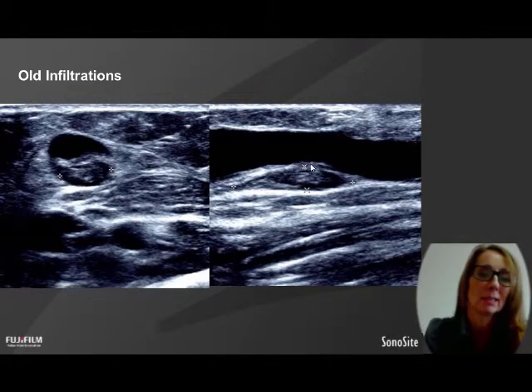Just made a slight little hole in the intima. The blood has filled that intima and reduced the actual lumen size quite dramatically. And you can imagine that on this cannulation they wouldn't have been successful. They would have possibly tried to change the angle, but if they didn't have ultrasound, they wouldn't have realised, and they would have probably abandoned. And then the next person who comes along would see that people have been cannulating there from the punctures and probably choose to cannulate in a similar area, maybe puncture here, and then not realise why they can't thread through and probably cut through this again and make this infiltration even worse.